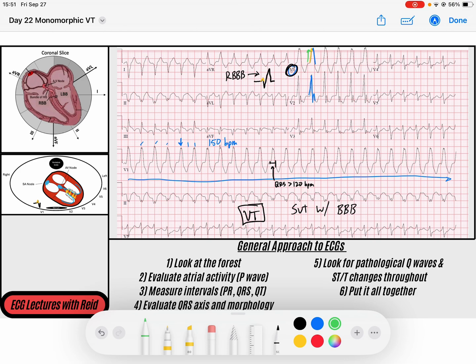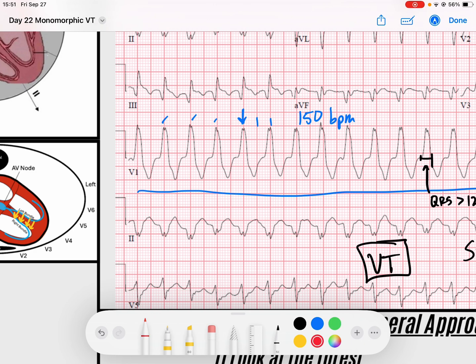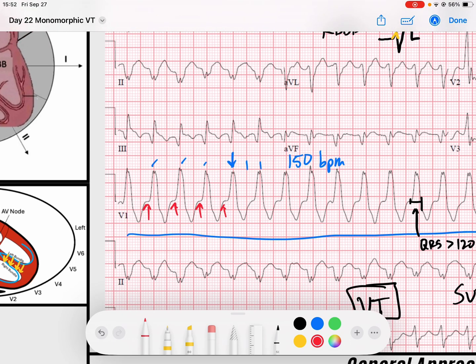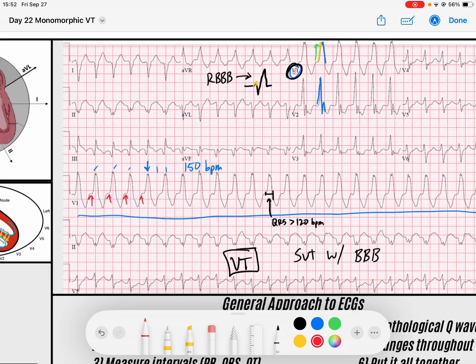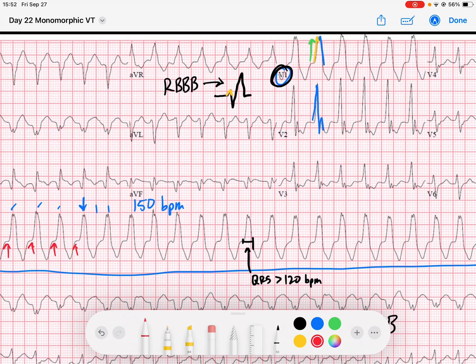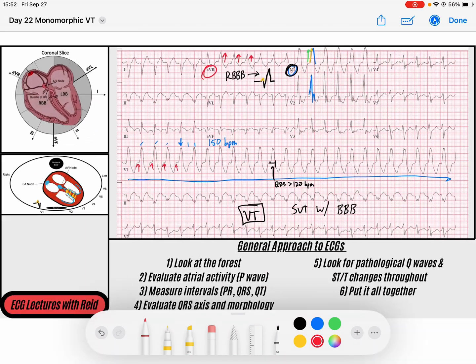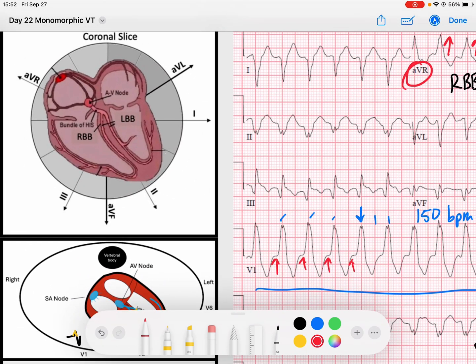Now let's keep going through my algorithm. I look for P waves — I don't see any atrial activity before any of these QRS complexes. Scanning through the rhythm, I notice there's an extreme axis. AVR is positive, and there are not many QRS complexes that will produce a positive deflection in AVR. That tells me my QRS axis is heading in that direction.